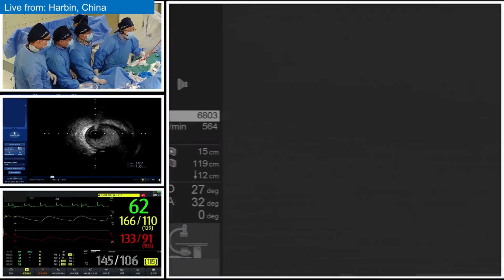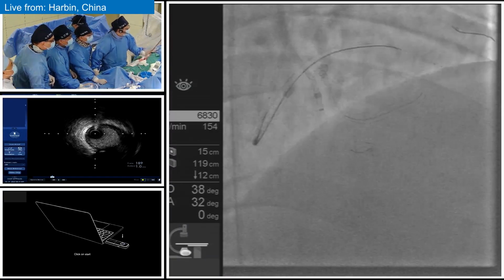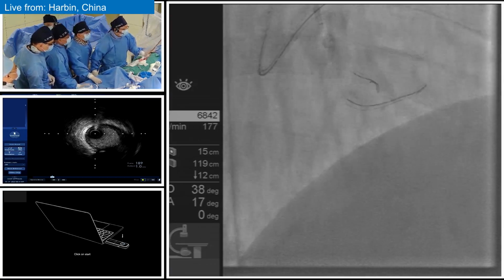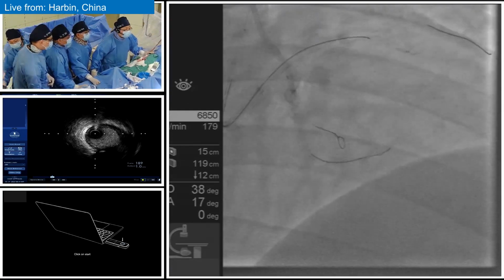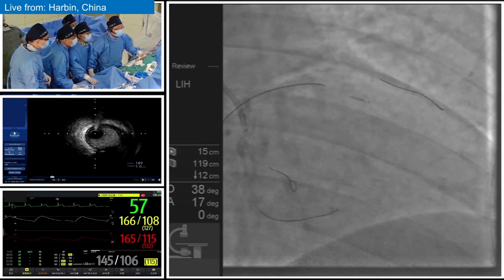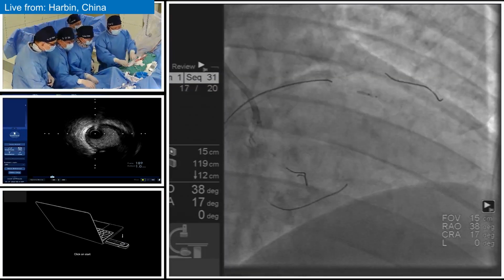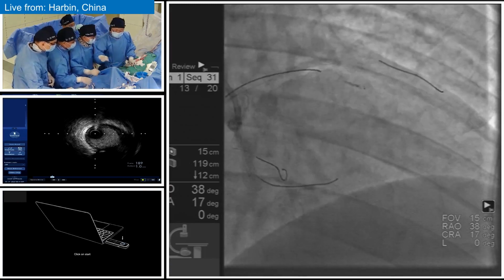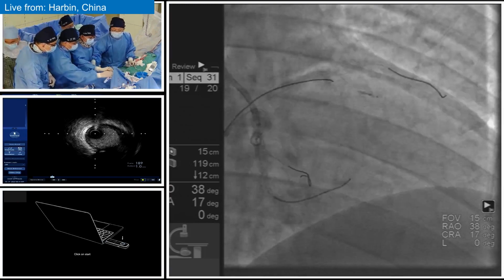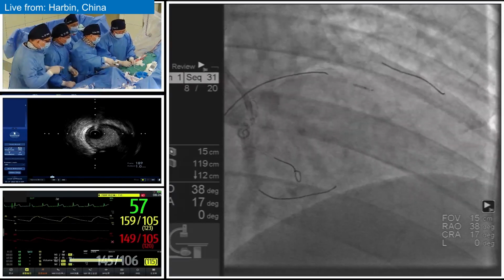Let's choose a view to make the Stingray be in one line here. Yes. Okay, could we see? Here it should be in one line. So we are choosing the right projections to keep the balloon's bilateral sides in one line, to choose the perfect puncturing direction.